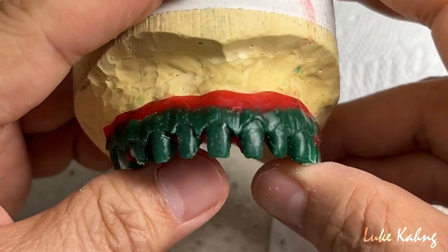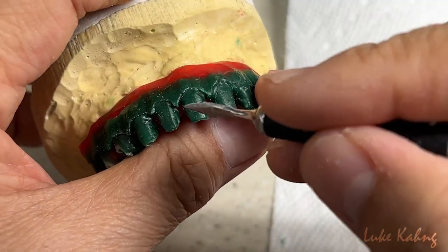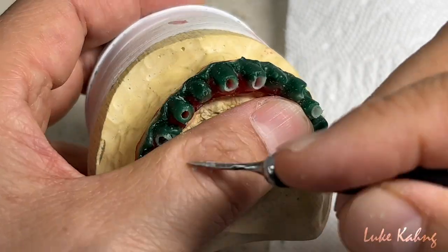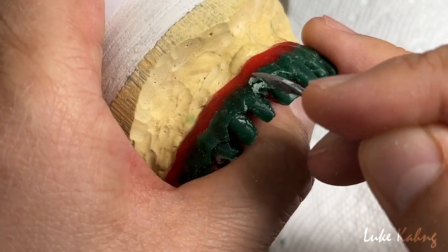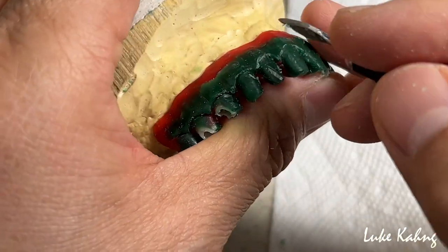Now we're going to sprue and cast. I can show the final work — the metal frame design, case by case. We bring it to the same level with trimming and grinding to make it even. Then we can make it a little bit softer. The facial contours we make nice.